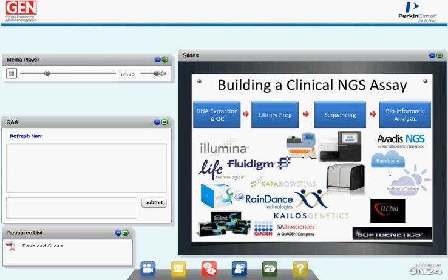On top of all of these different components, there's a lot of commercial competition, so there's a lot of different options. And as you're starting to build a laboratory, as we did about a couple of years ago, it was very difficult to try and identify which of these technologies was the most robust. And about every 6 months, we're seeing a turnover. And so in the very beginning, we tried to get our hands on as many different forms of this technology as possible to identify which one would provide us with the most robust workflow, really fitting in with that mission of trying to identify as many mutations as possible so that our clinicians could really make informed decisions.